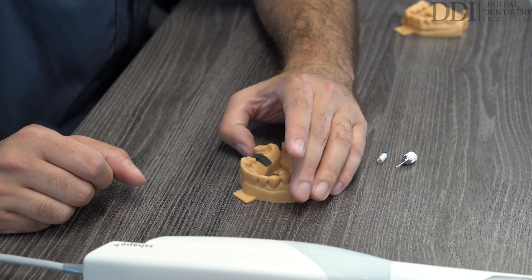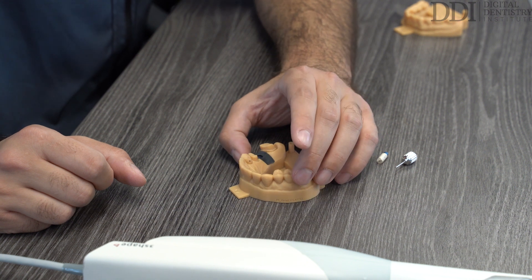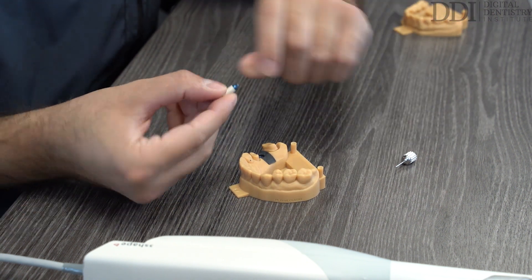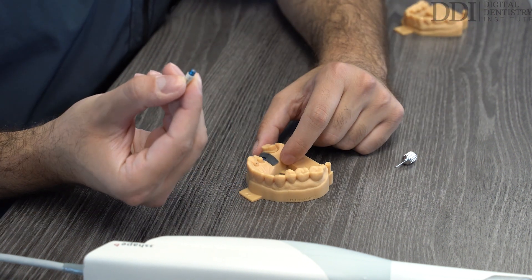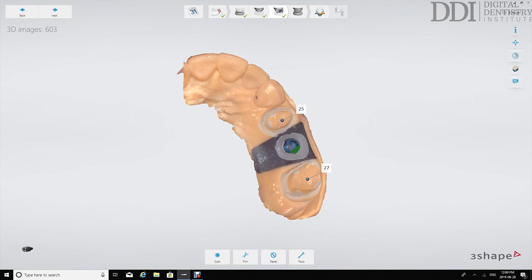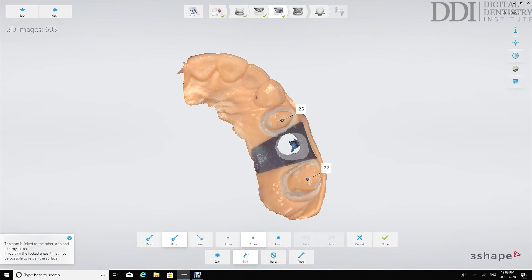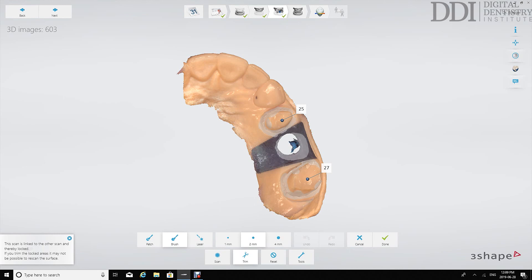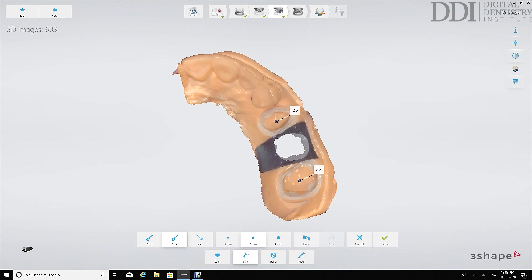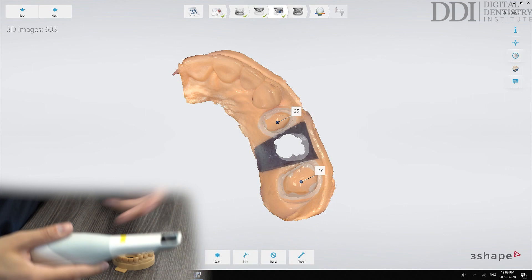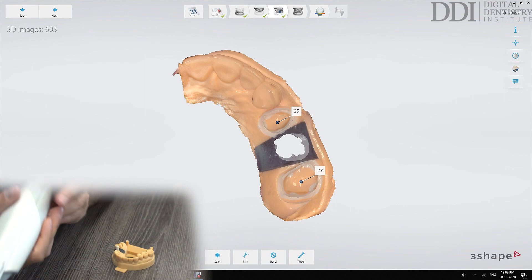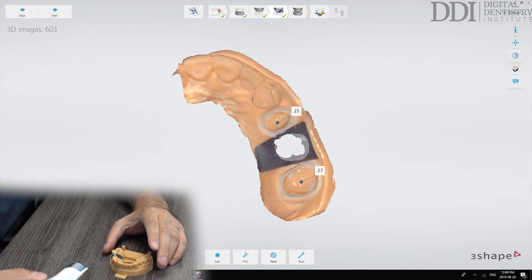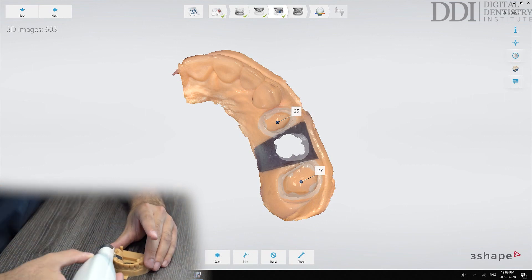At this stage what we do intraorally is we insert the scan body into the implant. Before taking the impression of the scan body we'll go to the trim tool and as you see it automatically trims the area around the impression but what we'll do is we'll ensure that it's trimmed away all signs of that connection just so that it doesn't interfere with that scan. That looks pretty good. Once we're at this stage we can go ahead and scan the scan body.